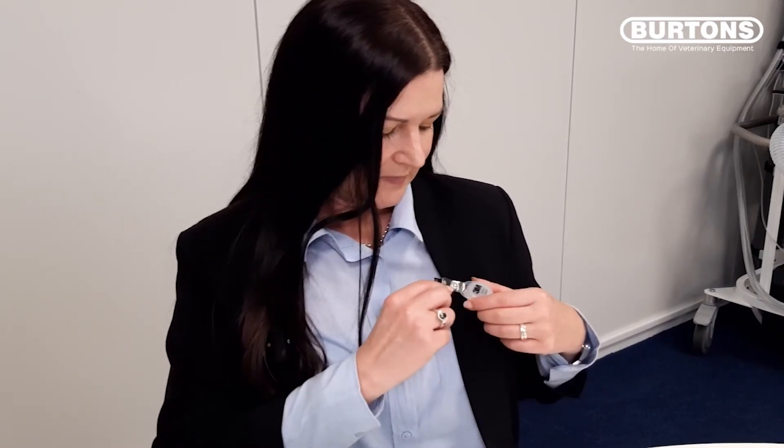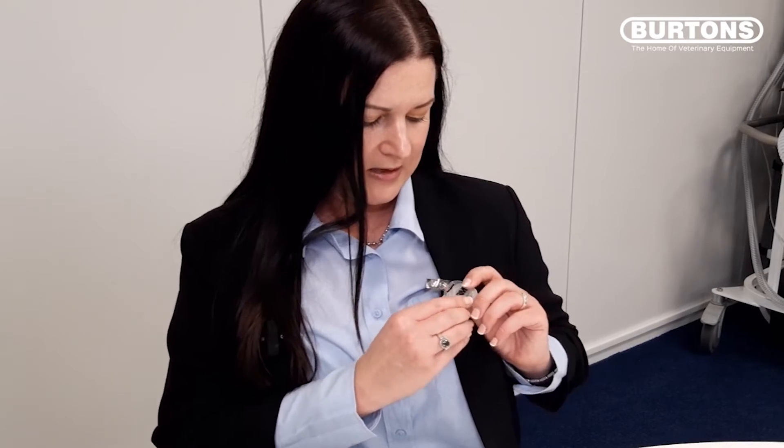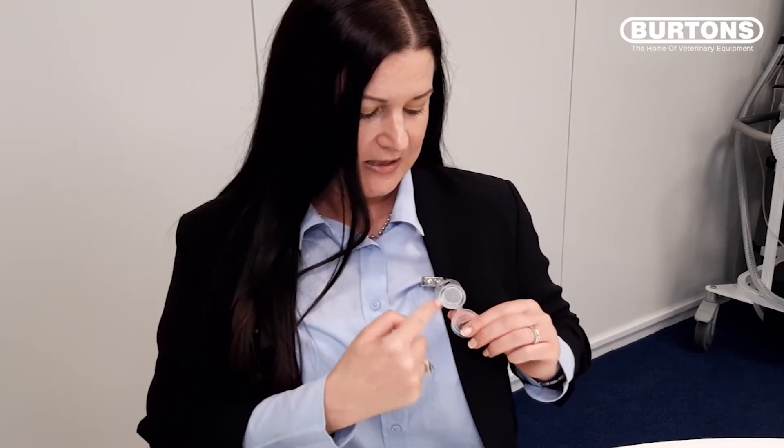To begin the monitoring process, using the flip top cap, open the badge, exposing the sampling holes.